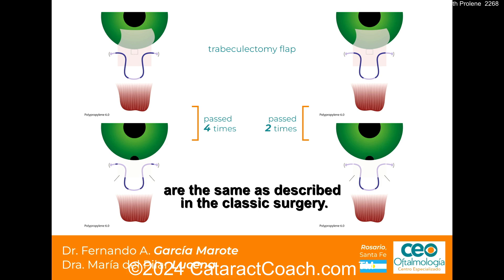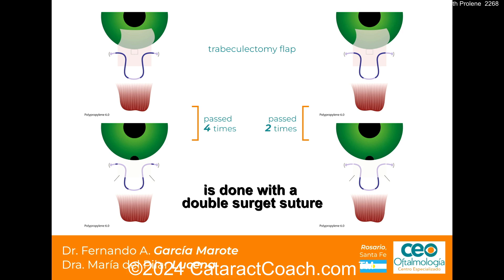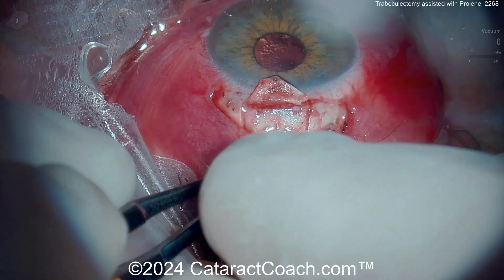All of the steps of the surgery are the same as previously described, and just making sure you have a good closure of the conjunctiva so it's completely watertight. Let's take a look at the surgery in action here.